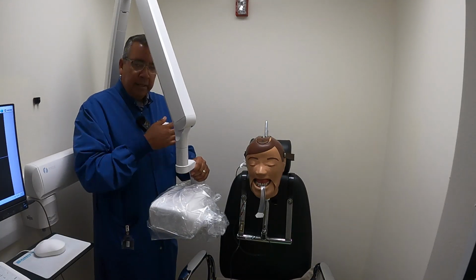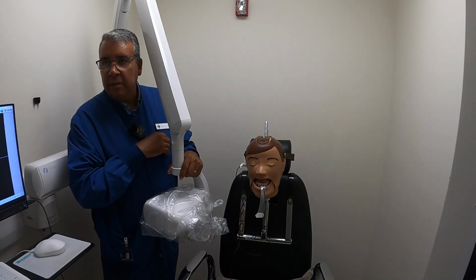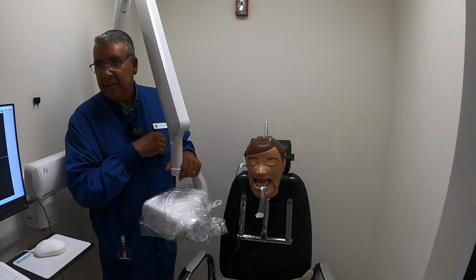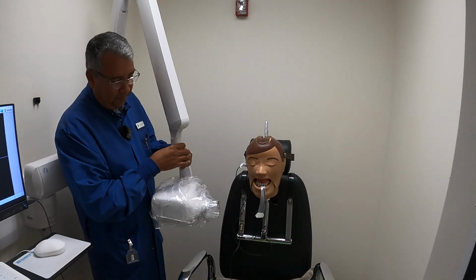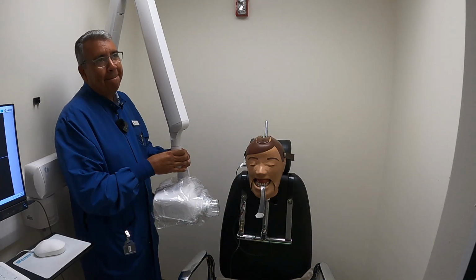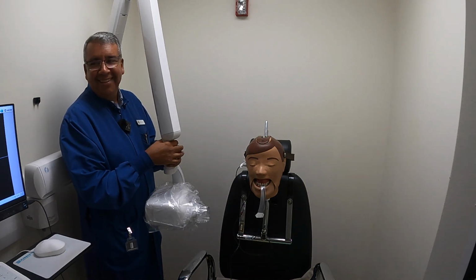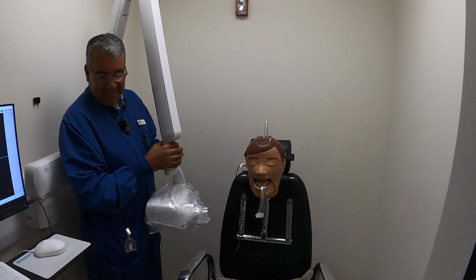And then the big question is, how do we find our horizontal angle? What's that based off of? The bite of the... I'm going to hang out for a little bit on this one, because it's the same thing that we just did.